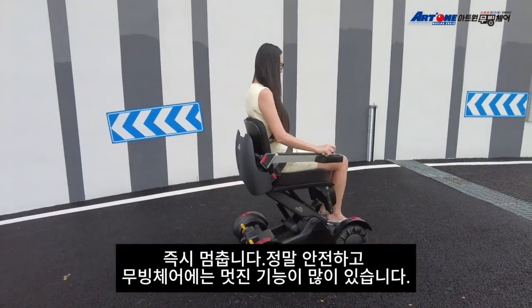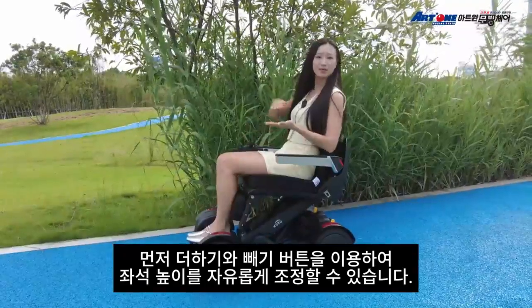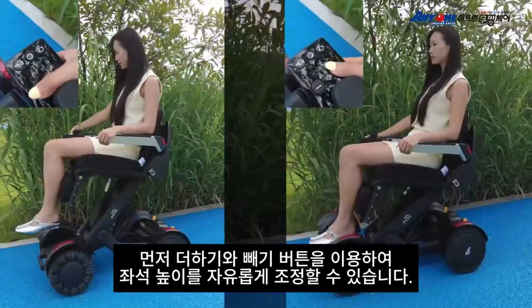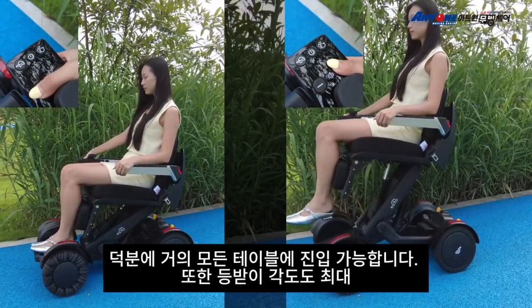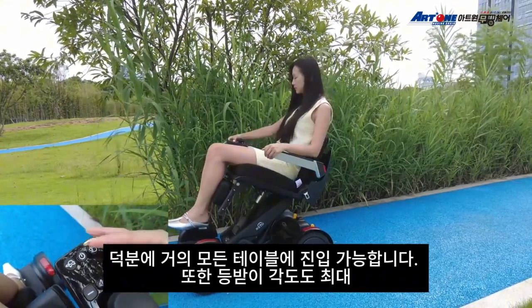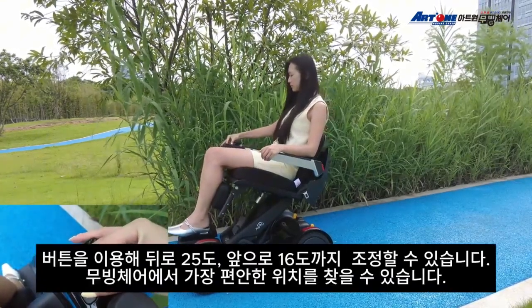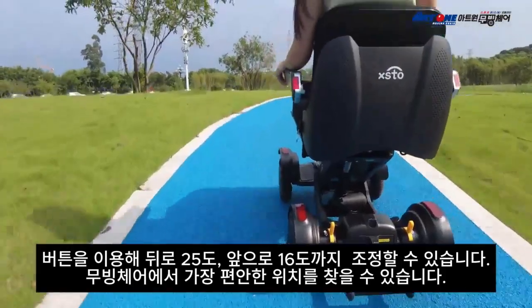The M4 electric wheelchair has a bunch of cool features. The seat height is adjustable — just click the plus and minus button to adapt to almost any table. You can also adjust the tilt angle, with a maximum of 25 degrees backward and 16 degrees forward, so you can find your most comfortable position in the wheelchair.